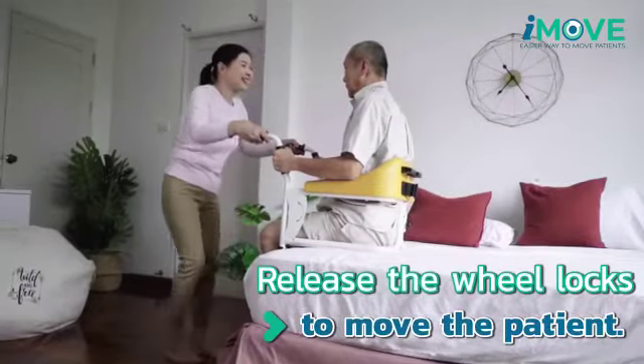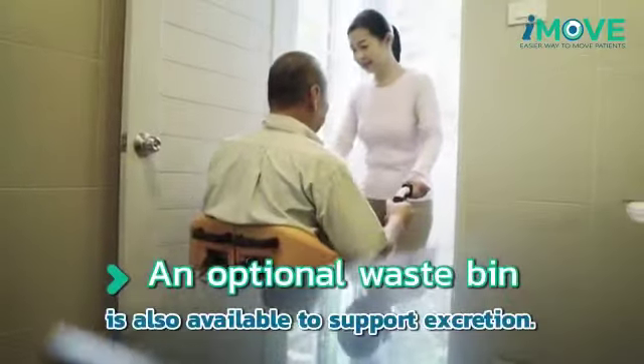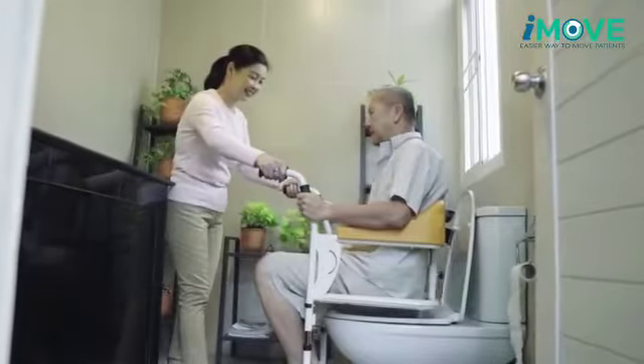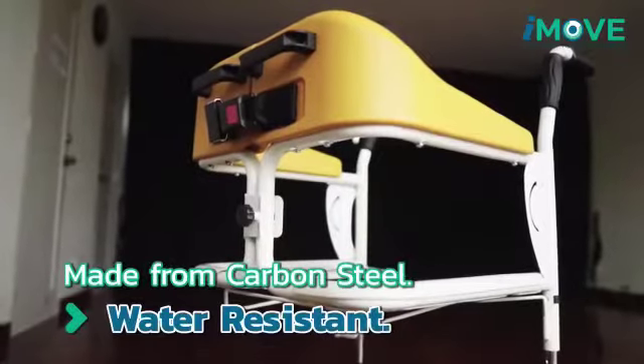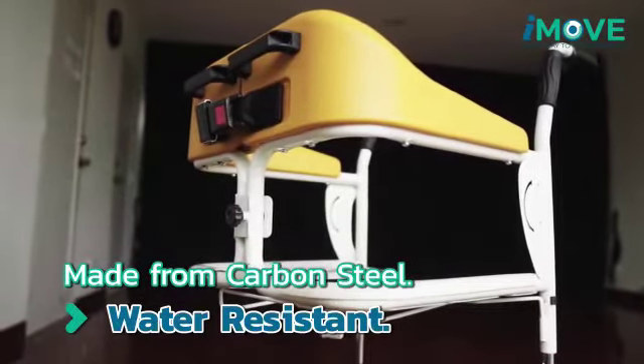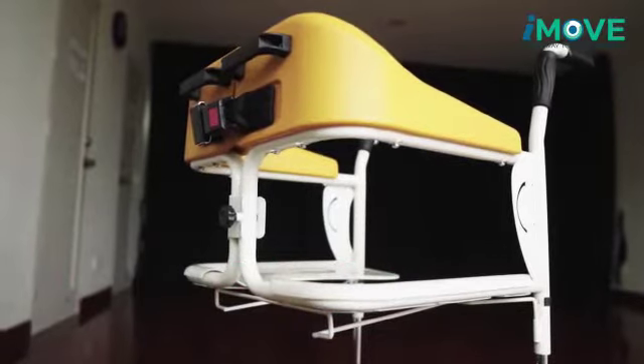It can also be wheeled over the toilet bowl so that the patient can relieve themselves without even leaving the chair. It can also be used to bathe the patient. The wheelchair is made from carbon steel which is coated outside with rust prevention agent.